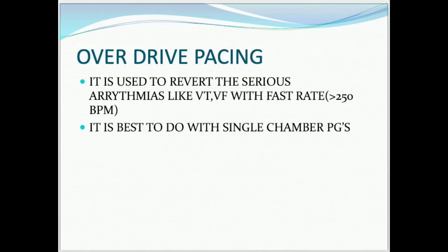Overdrive pacing. One of the major advantages of transvenous pacing is overdrive pacing during life-threatening arrhythmias. It can be done easily by single chamber temporary pacing. In order to perform overdrive pacing to terminate arrhythmia, the pacemaker needs to deliver a faster pacing rate, slightly above the intrinsic rhythm.